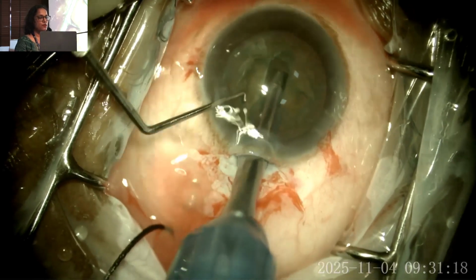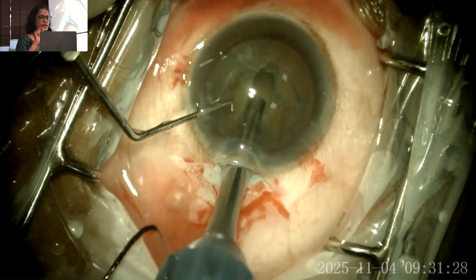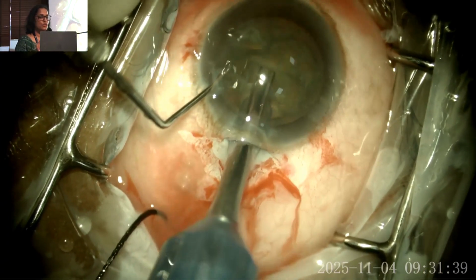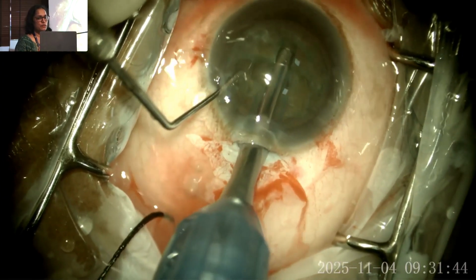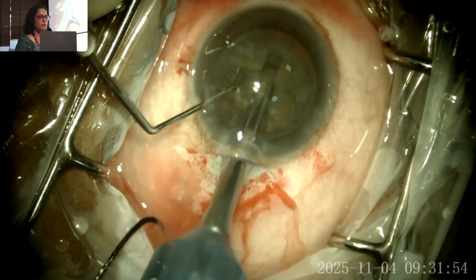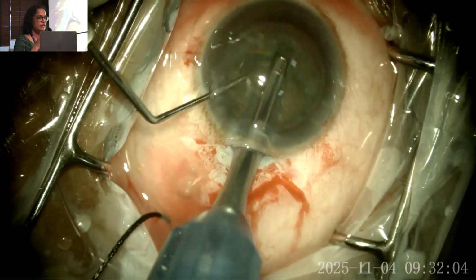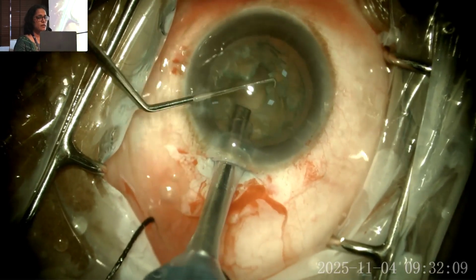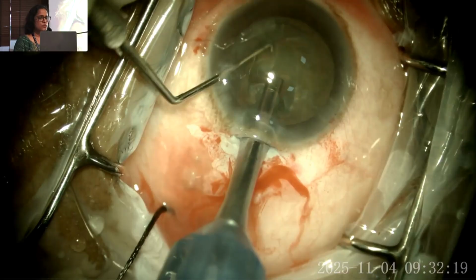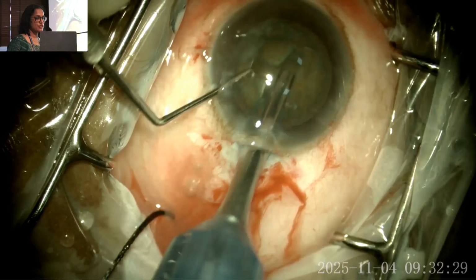Also, different phaco tips have different sizes. If it is a 1 mm phaco tip, you can go twice the size of the phaco tip. You have to see the red glow. We have many cues to know how adequate depth has been reached, like the red glow, the change in fibers, the ease of trenching, and the size of the depth of the trench.